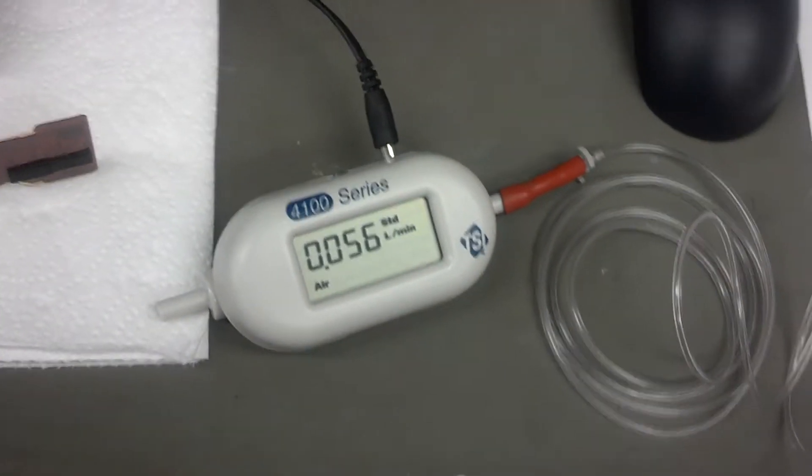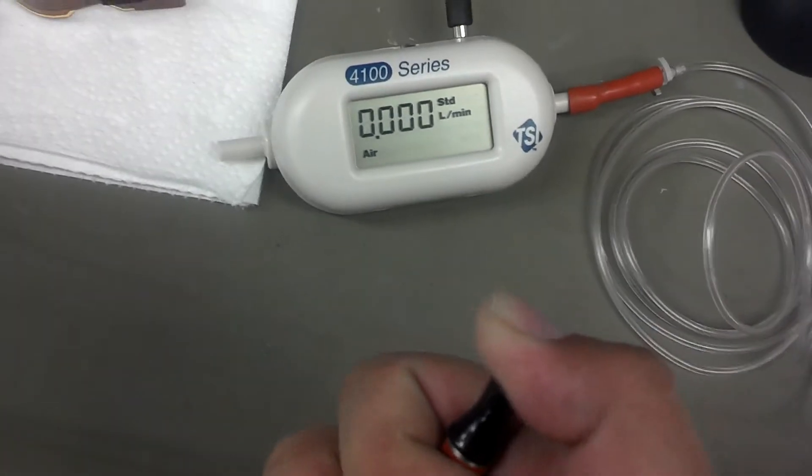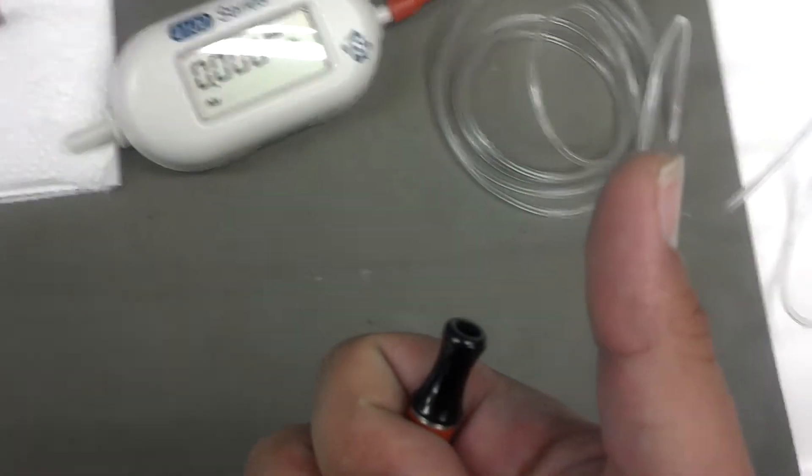There you can see it. Now this input hose, I'm going to cover up, and you can see that it drops down to zero. Let go. Now I'm just going to do the opposite.